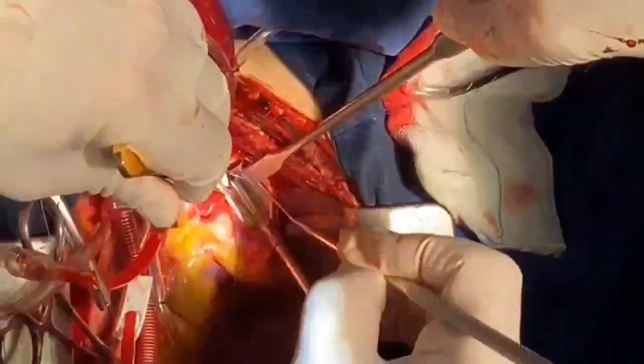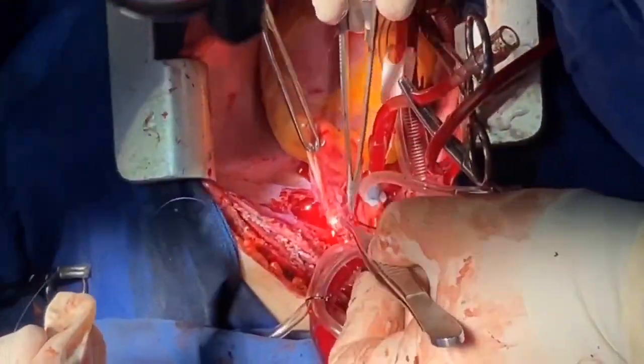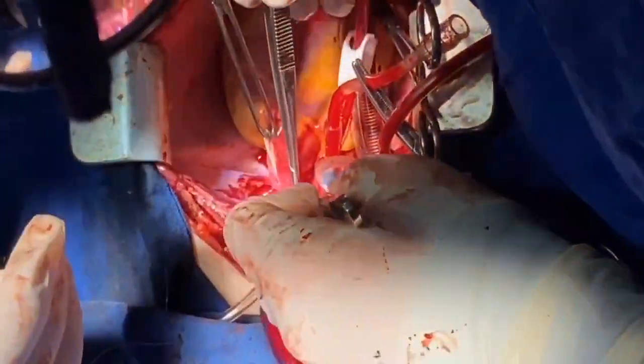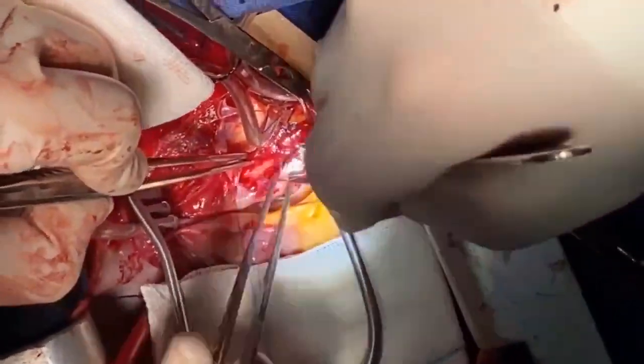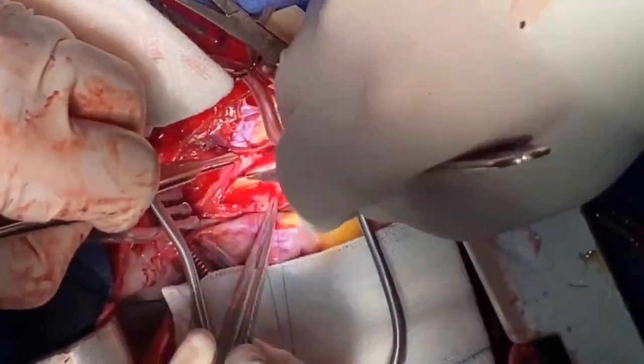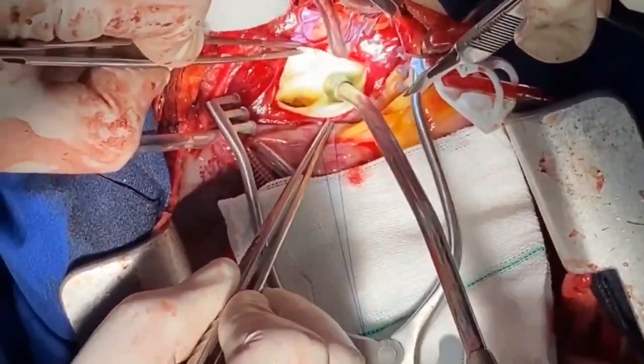As you can see within the video, we had a patient with chronic thromboembolic pulmonary hypertension confirmed by transthoracic and transesophageal echocardiography, as well as right side heart catheterization and CT angiography. Median sternotomy and bicaval cannulation were performed for the patient after administration of heparin.